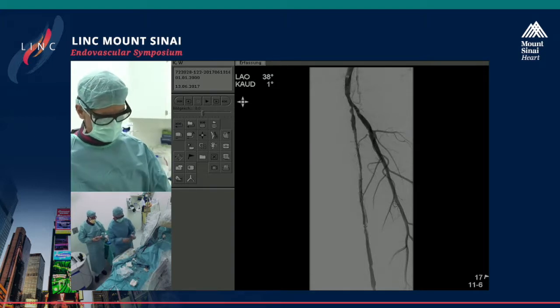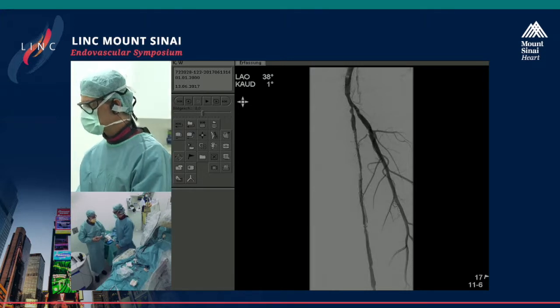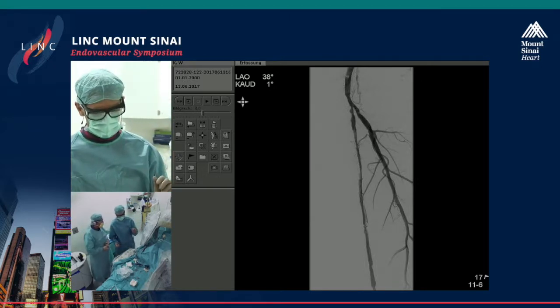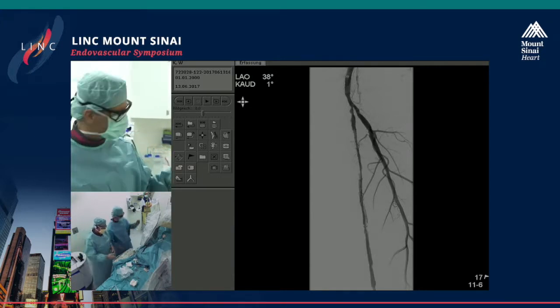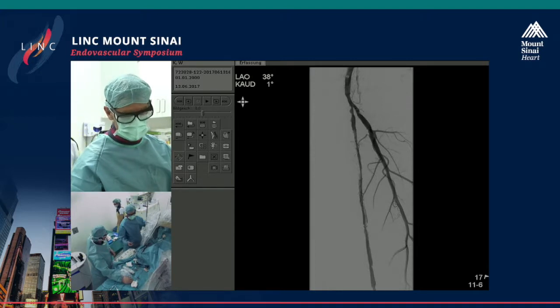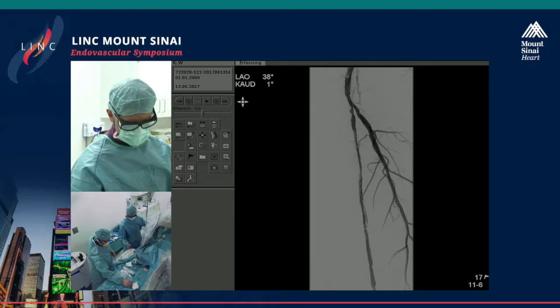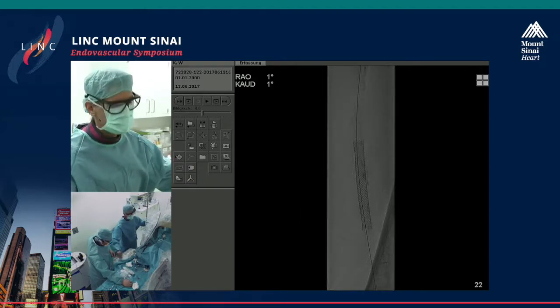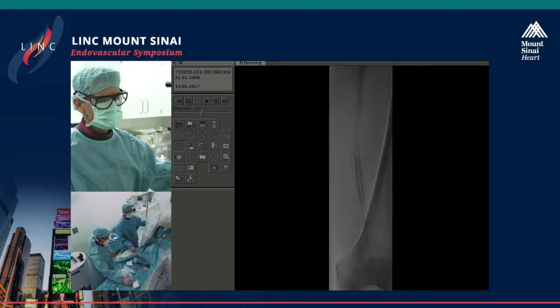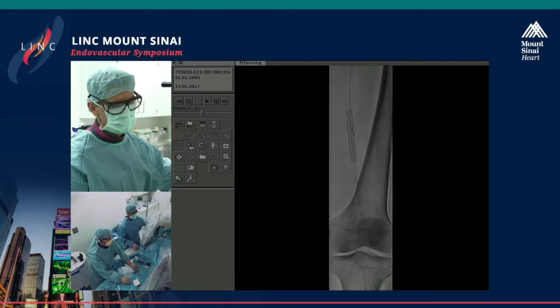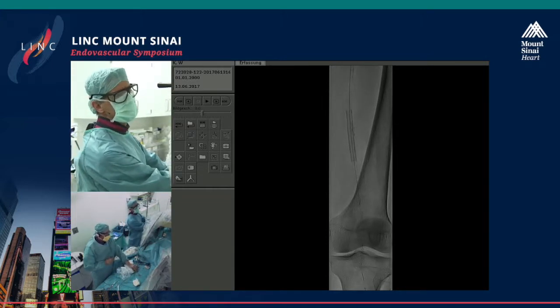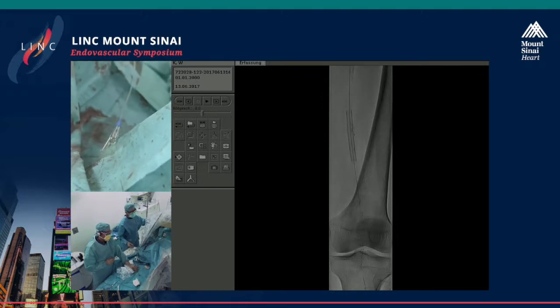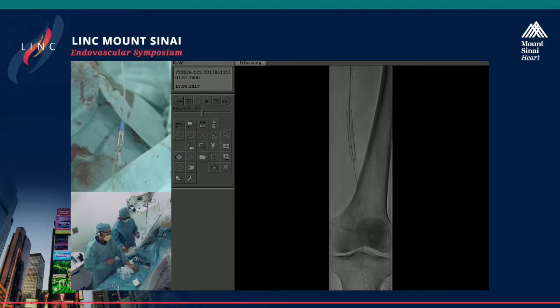An argument can be made to reline this — get distal and tackle this thing distally. The problem in this case is the proximal landing zone; it's a very difficult landing zone there. But you've got 3mm scallops on the heparin-bonded Viabahn, so you could safely deploy a stent graft and cover the entire track. We just saw the data for ISR — it's got the best data for long lesions as long as it stays above the knee. Before committing to relining, I would try to balloon with a DCB and reassess. That's what I would do.